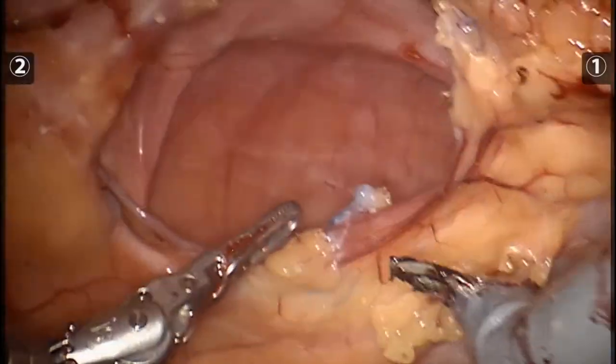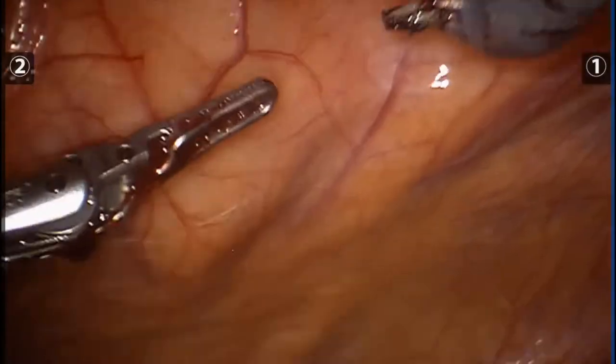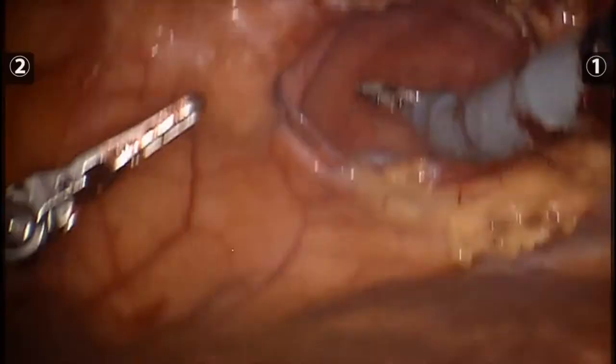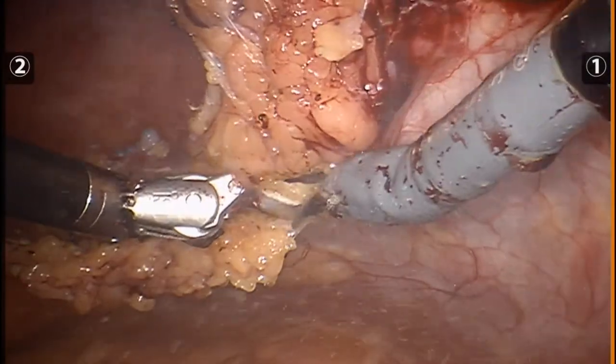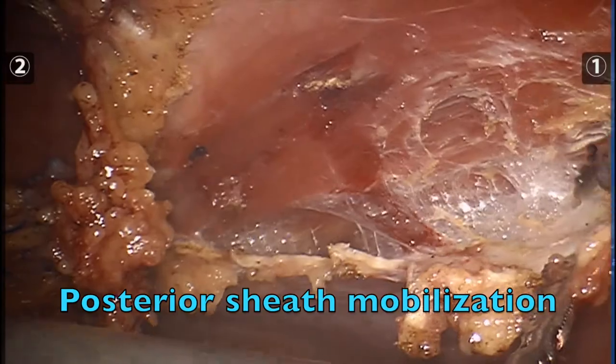Here you can see the previous onlay, or an eventrated previous IPOM mesh. This is the xiphoid process. After isolation and complete evaluation of the hernia defect, the posterior sheath is incised and divided off the rectus abdominis muscle.